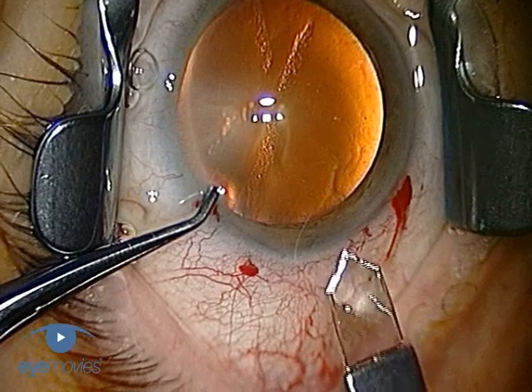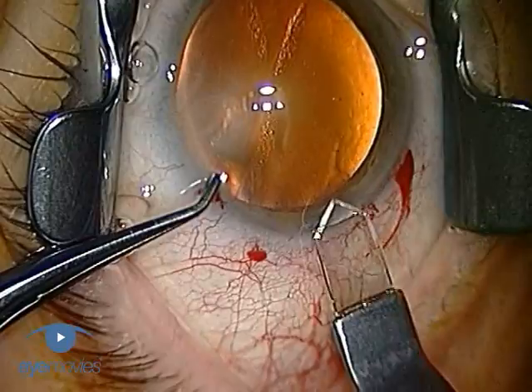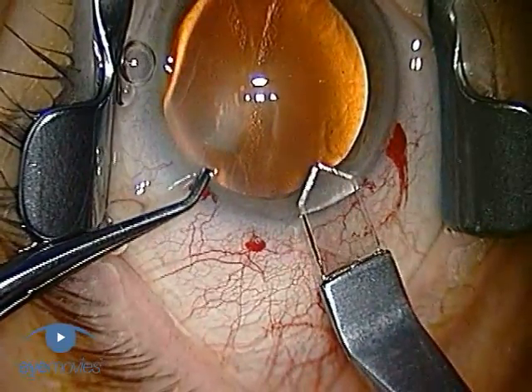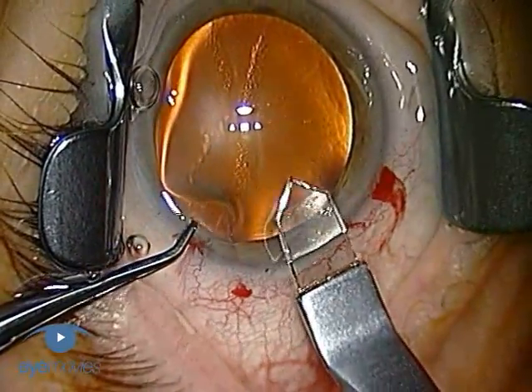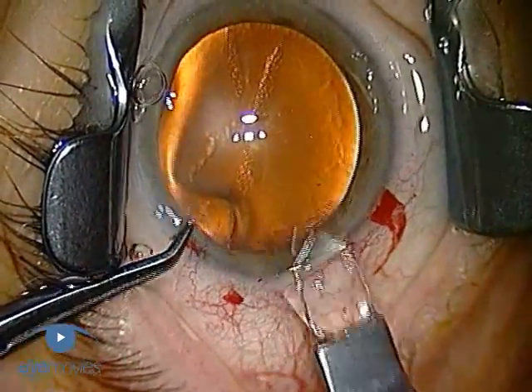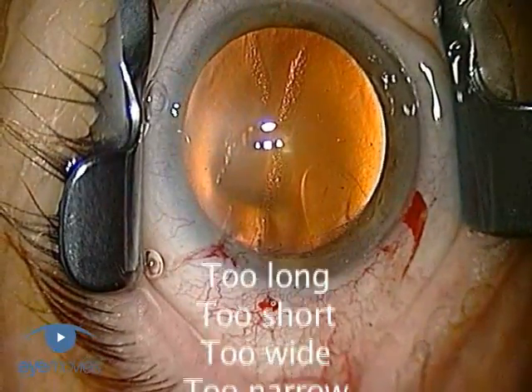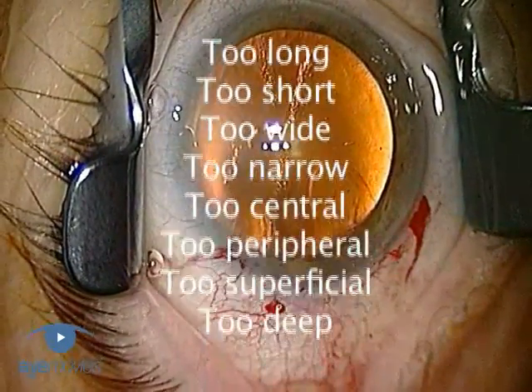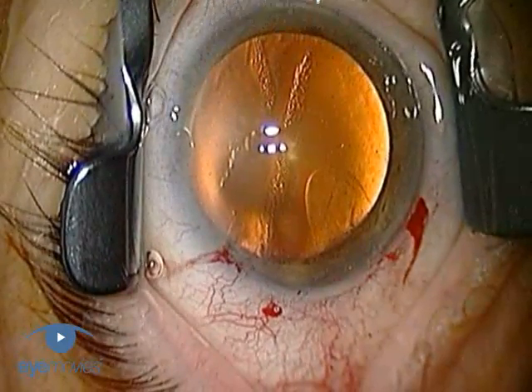The main incision is the very first surgical step in FACO, and it's an important one, because all the subsequent steps depend upon its correct construction. Get this wrong — and there are many ways in which you can do so — and you'll spend the rest of the operation paying the penalty for it.